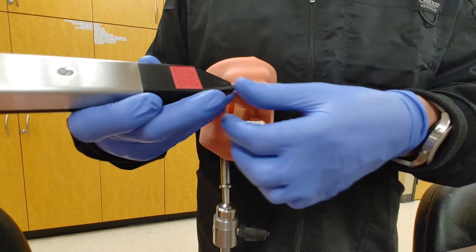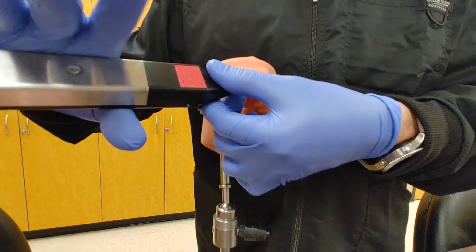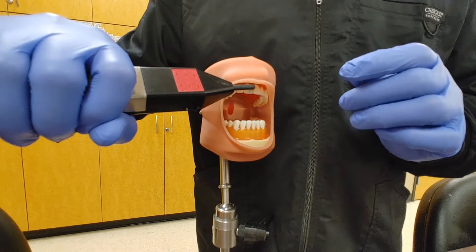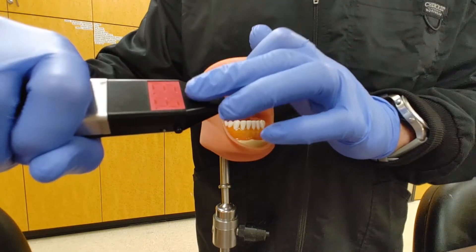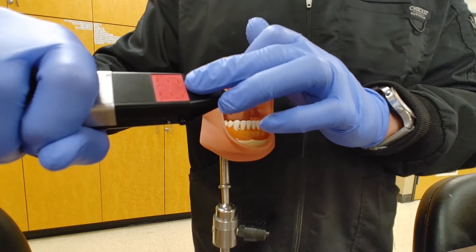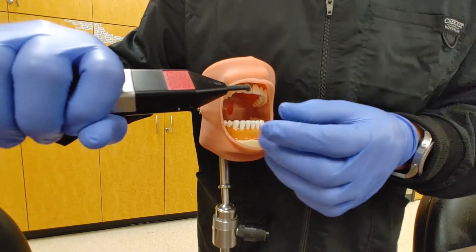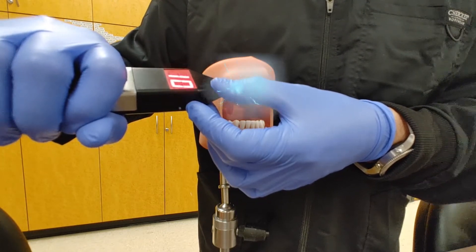Once applied to the tooth, inform your patient to grab on to the base of the electric pulp tester where the metal is — this completes the circuit so we can deliver the shock to the tooth. They are in control of when they feel it and can remove it, rather than us continuously shocking them if they don't raise their hand. Don't freak them out with the whole electricity concept — just let them know they'll feel a tingle or a warm feeling, and to raise their hand or remove it from the tooth when they feel it.